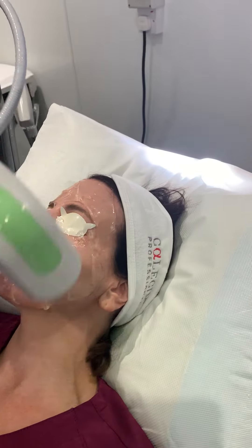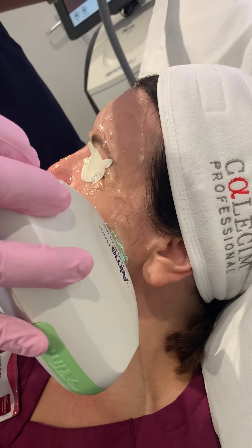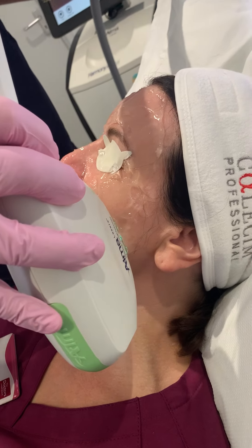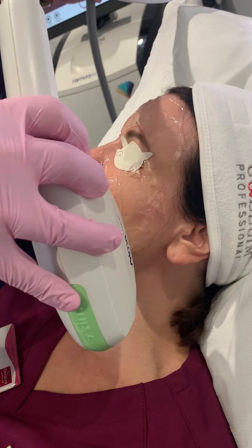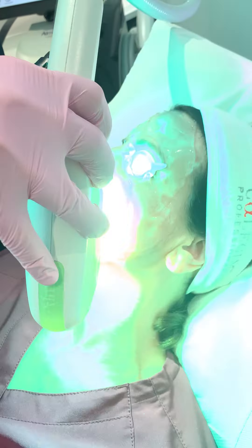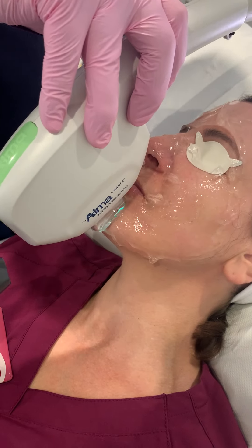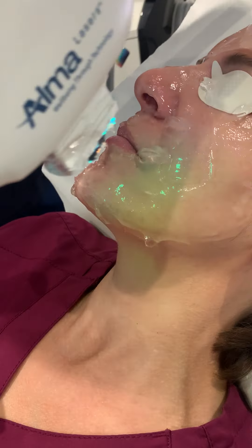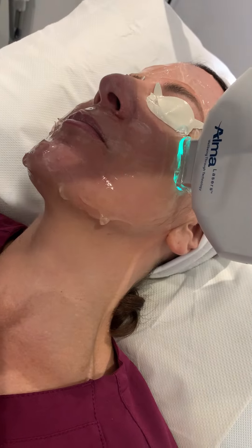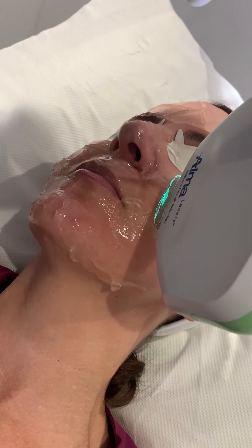Having done it that way around, we then actually come and do it this way. And again, this is very rejuvenating. The skin likes the heat injury — that is effectively what we do in there. It's a controlled heat injury.